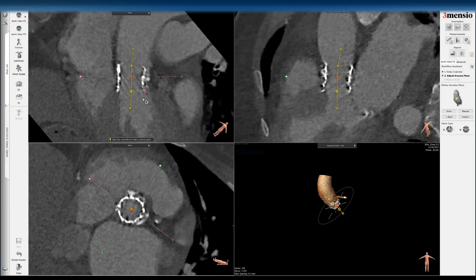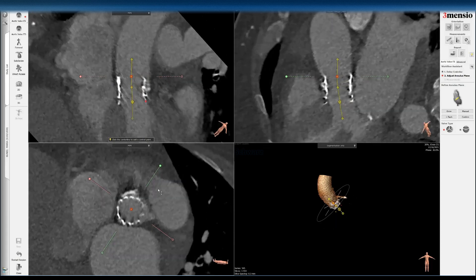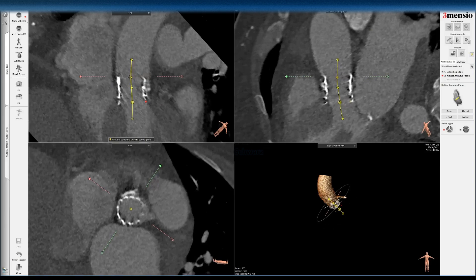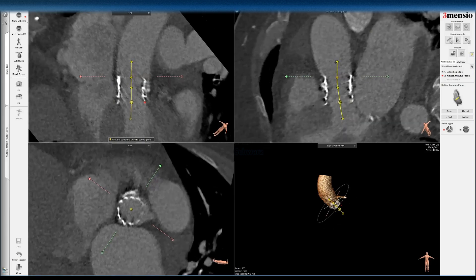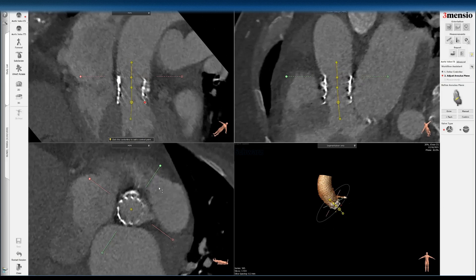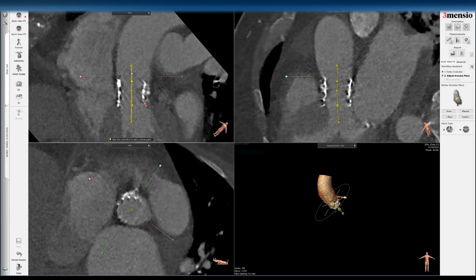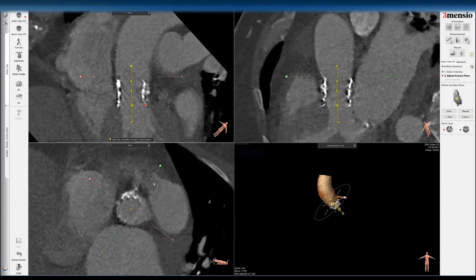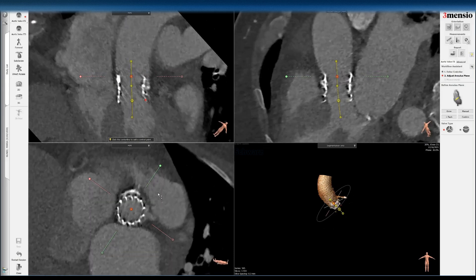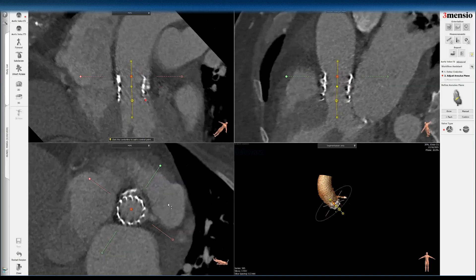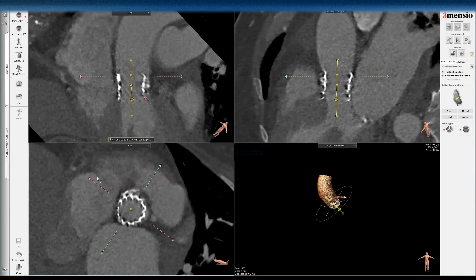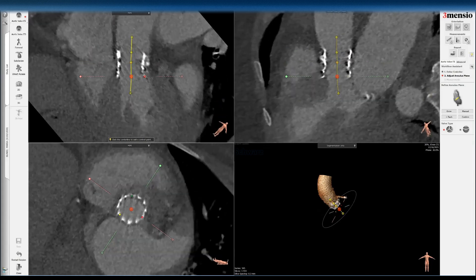I'm going to go in a perpendicular manner to make sure the frame is as symmetric as possible. Sometimes it's not feasible and you have to accept it. Once you are satisfied with the centerline determination, you click confirm. So now you have the inflow of your SAPIEN 3 valve.